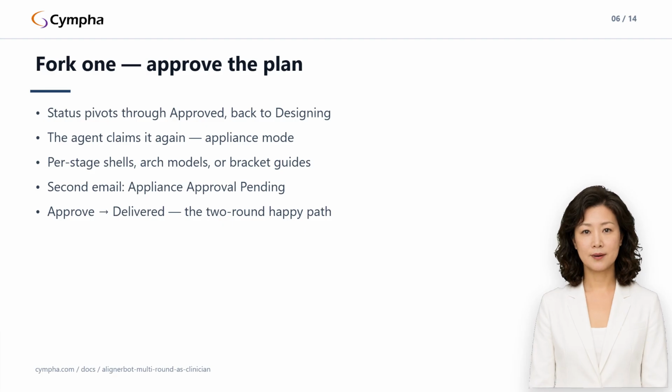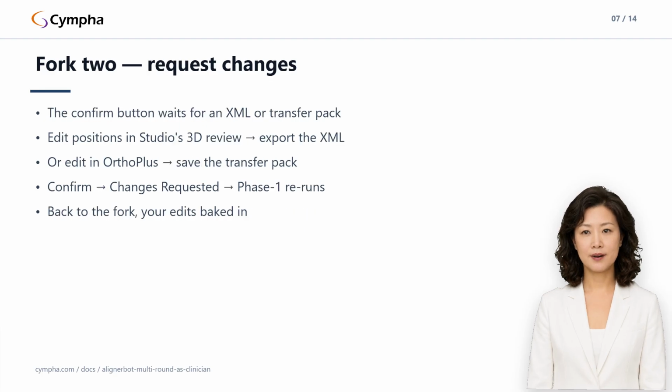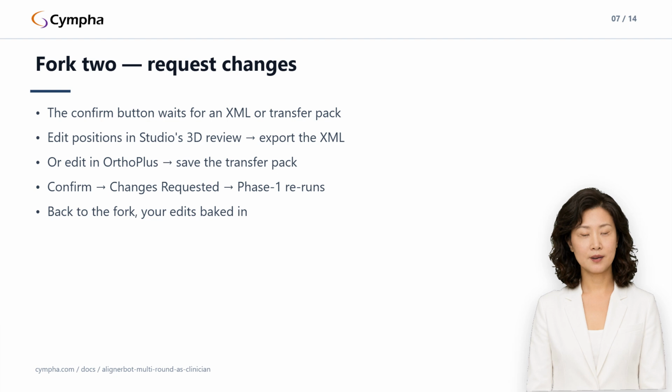Here's the trap built specially for solo operators. You may be tempted to think, I'm the lab manager too, I can just chat the changes to myself and handle it. That doesn't work, and it's worth understanding why. The artifact requirement isn't a policy gate protecting some other party, it's a technical one. The OrthoPlus planning cascade has no English parser. A typed instruction like move that tooth buccally has no input slot to land in. There is simply no place in the pipeline where prose becomes planning input.